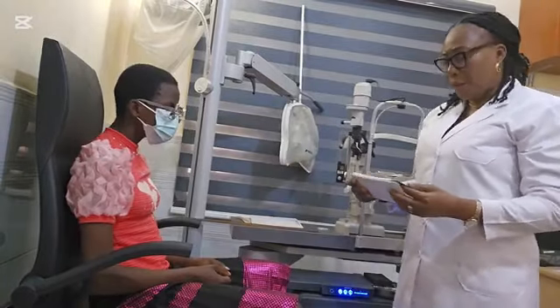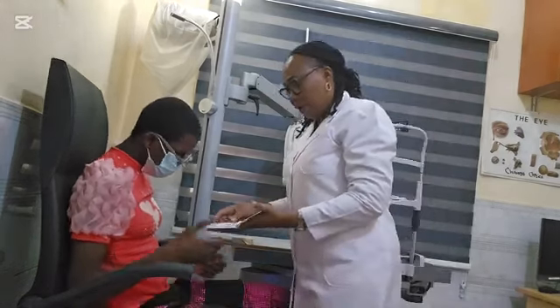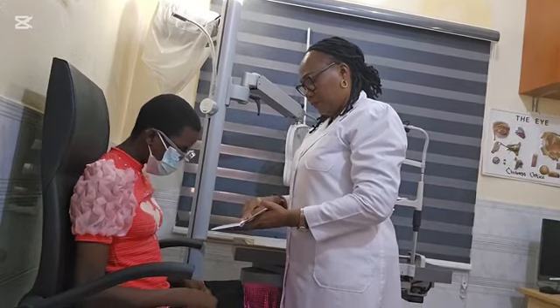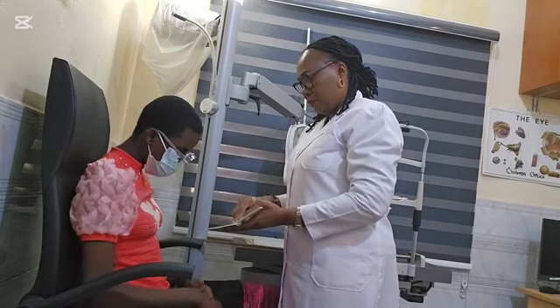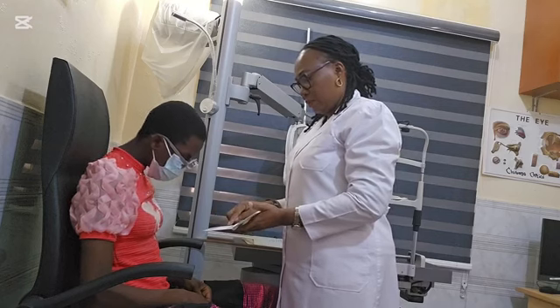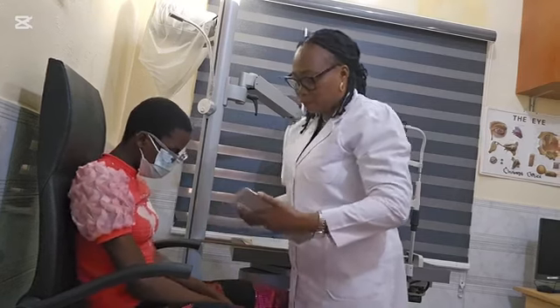Okay, so now we are going to do her contrast sensitivity at near using the low contrast flip charts. Okay, you can point. Okay, yeah, call the shape out. Square, circle, arc, circle, square, arc, house, square, circle. Beautiful. So her contrast sensitivity is 1.25%.